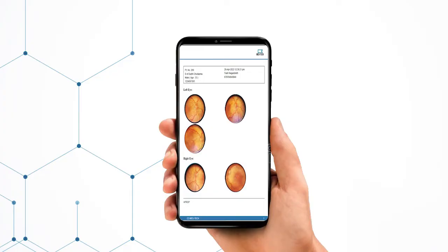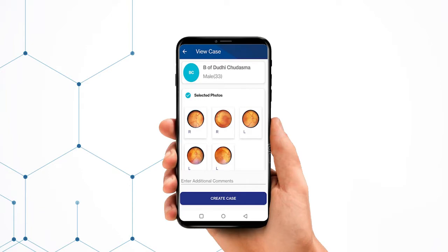Once the images are captured, you can crop, rotate, or edit as desired. After selecting the images, there is an option of adding comments at the bottom of the page. You can add the likely diagnosis, any risk factors, and any other details. Once added, you press the Create Case button.